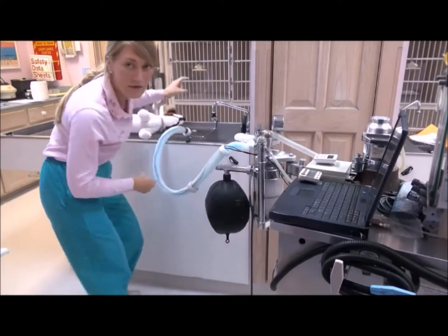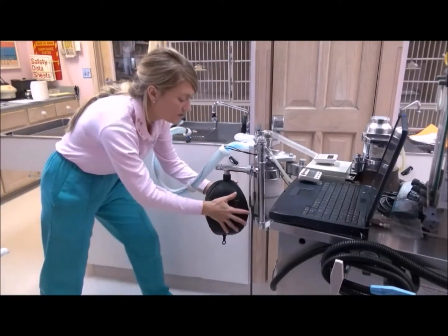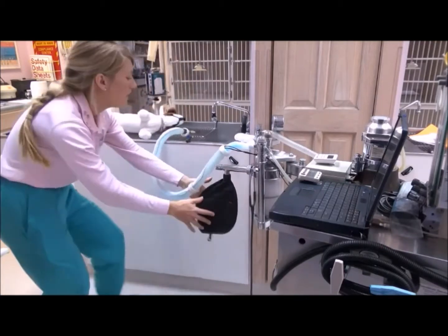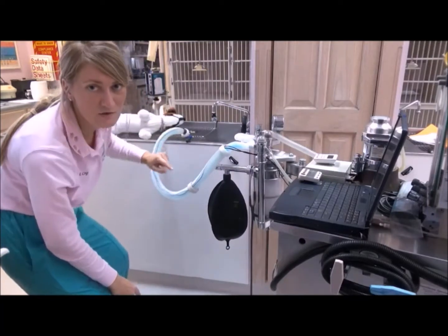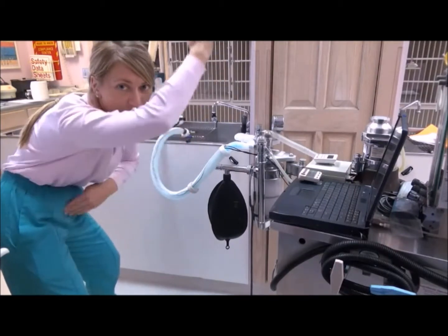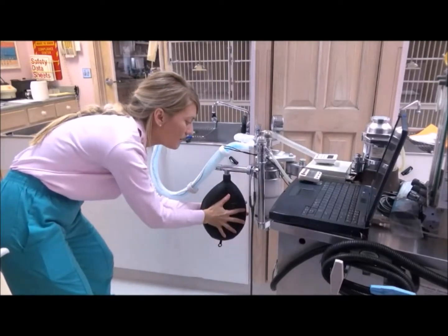And then with that, while that person's giving the chest compressions, this second person would be in charge of administering the breaths for the patient. So you would want to do about 10 breaths per minute. And it's important that the person looks at the patient's chest, because you want to mimic as normal a breath as you can. Obviously, you don't want their chest expanding to an unsafe level, and you also don't want to take too long making a breath.